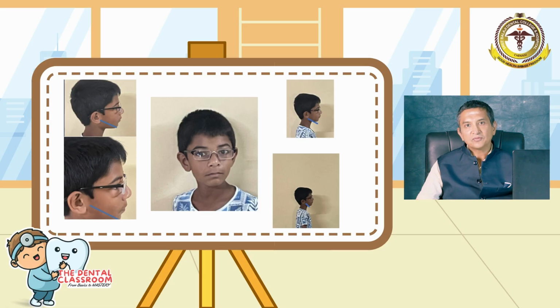You can see these 4 pictures when it is a photograph. For obvious ethical reasons, we cannot take a radiograph, but I hope this photograph will make you understand the importance of standardization. The fundamental difference here is the blue line, which depicts, for example, the mandibular length. You can see that the length of the mandible differs depending upon the magnification of the facial photograph.